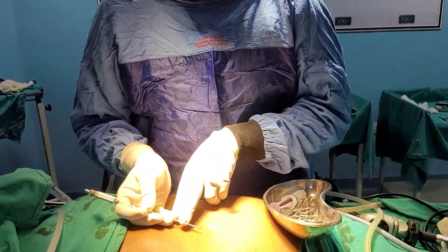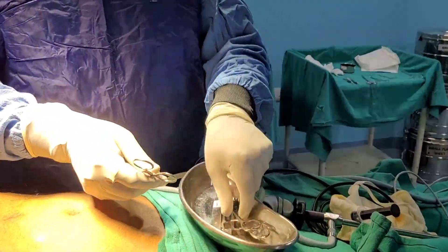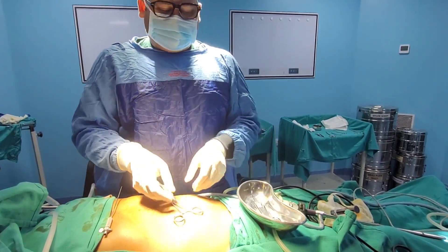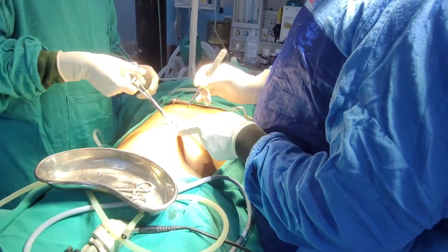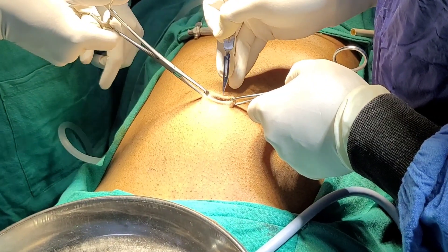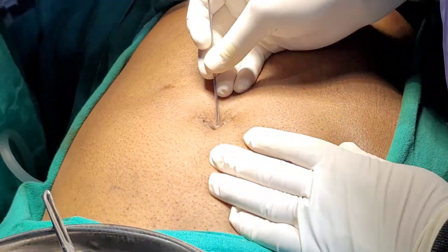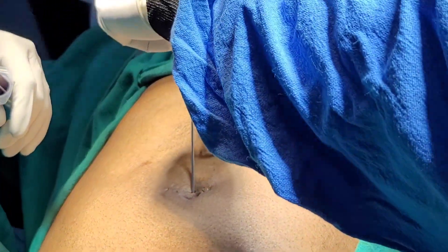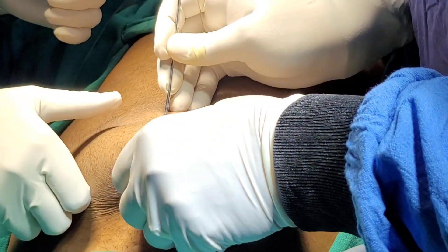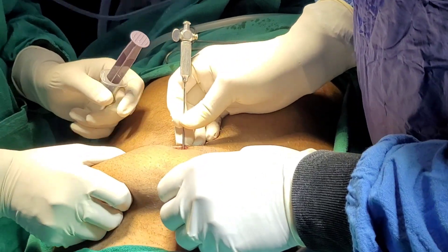The rule is: abdominal thickness plus four centimeters. The instruments required are two Allis clamps and an 11-number blade. We are going for a supraumbilical axis. Always remember, we go 30 to 45 degrees — you can see this angle. You lift up the abdominal wall and go one click and two clicks, and it is inside.